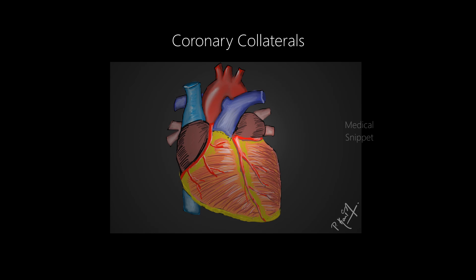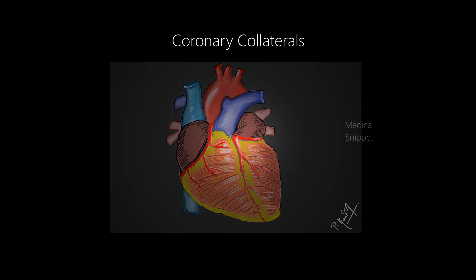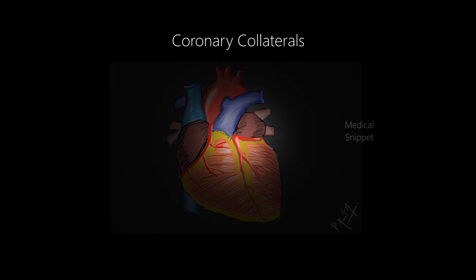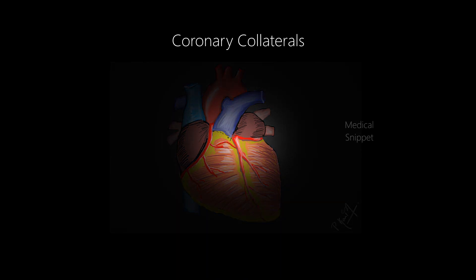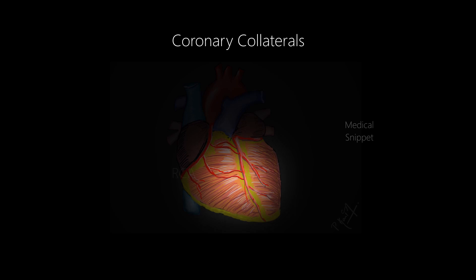Coronary collaterals are also called natural bypasses. These are anastomotic connections without an intervening capillary bed. They can be between portions of the same coronary artery or between different coronary arteries. For example, in this case there is collateral circulation between the right coronary artery to the left anterior descending artery.